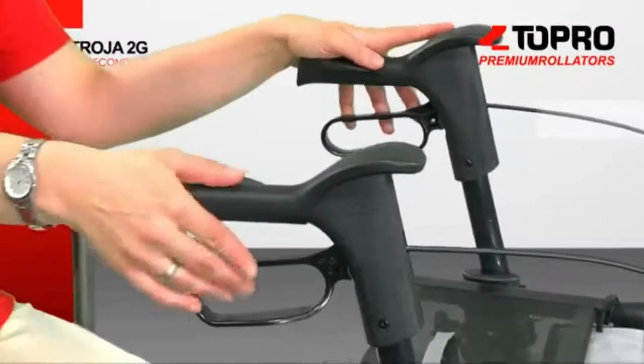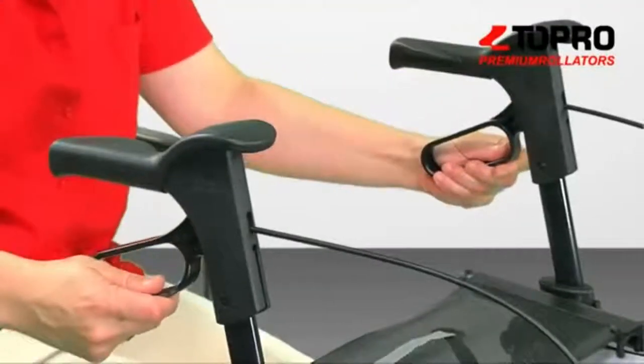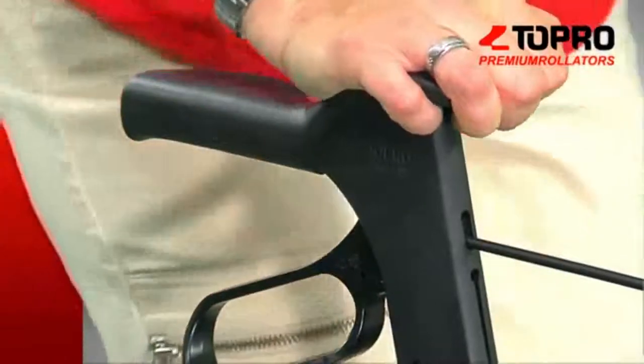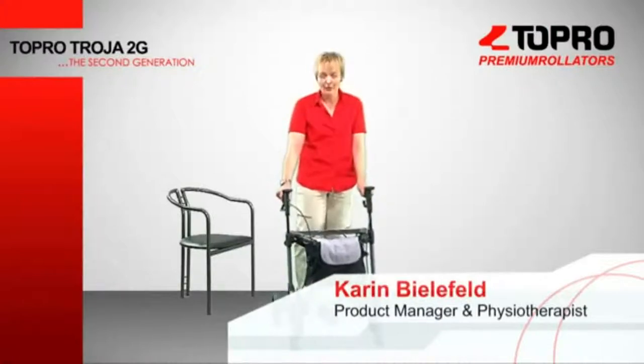The ergo grip is one of our developmental highlights. It now has a grasp knob to support you when standing up and additionally to support your walking. To stand up, you park the 2G in front of you, pull the parking brakes, rest your hands on the ergo grip and lift yourself to an upright standing position.